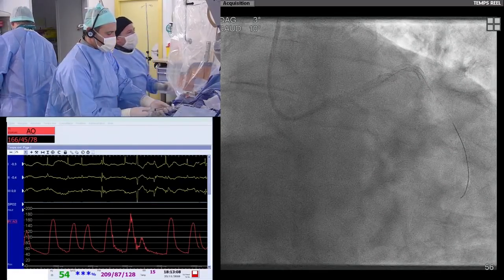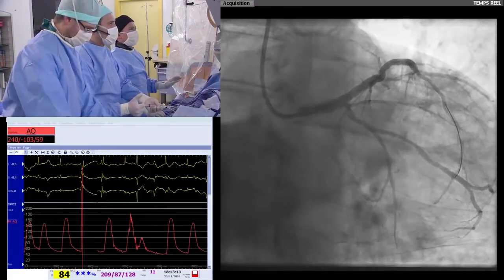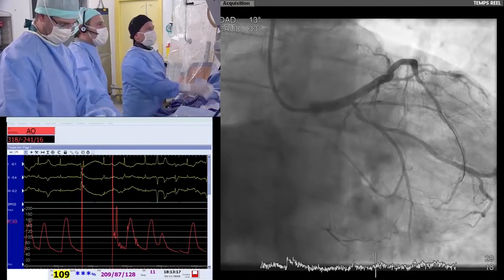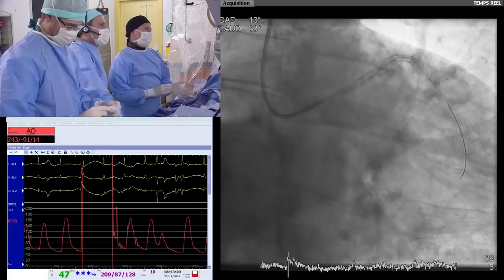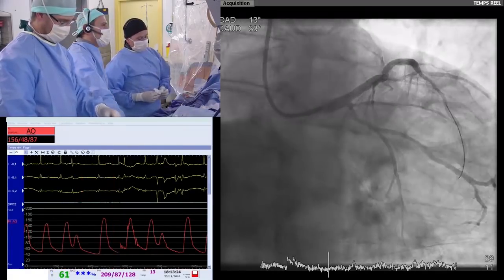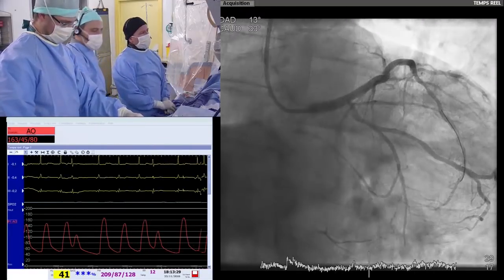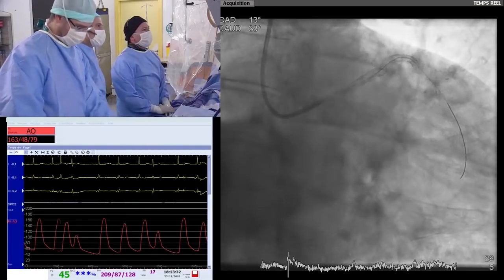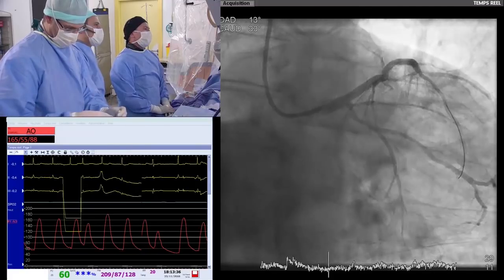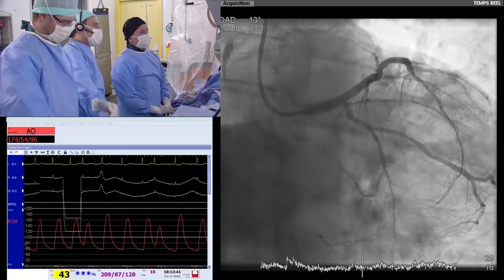Ready? As you know, I am engaged inside the stent. Yep. So actually, it's not bad, the ostium of the circ. Yes, it's not so bad. Exactly untouched. So usually we open the large branch because in the future we can have to treat the circumflex and the marginal. So you do it by default, actually. Yes, but you know this patient is 80, so we can also accept this result and just follow.